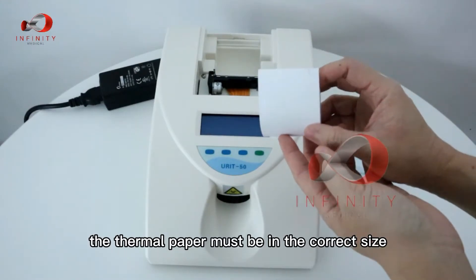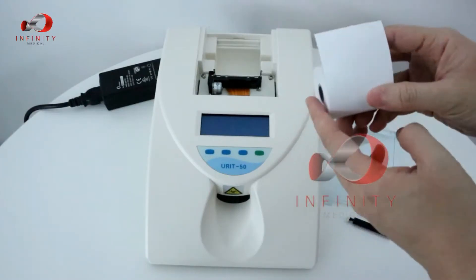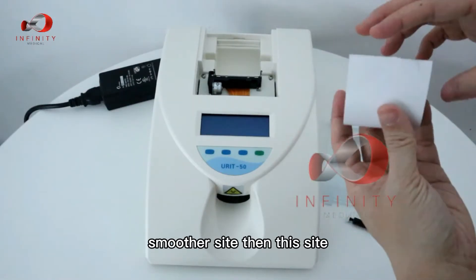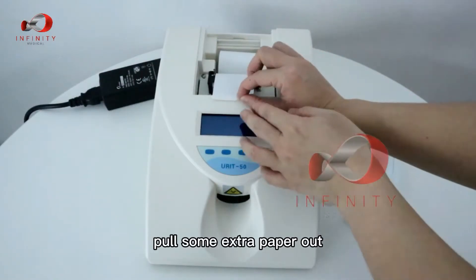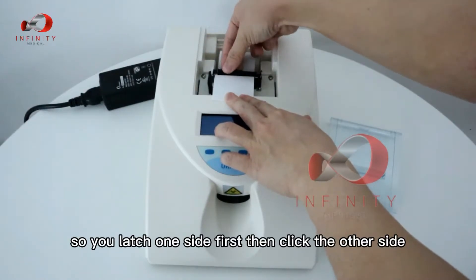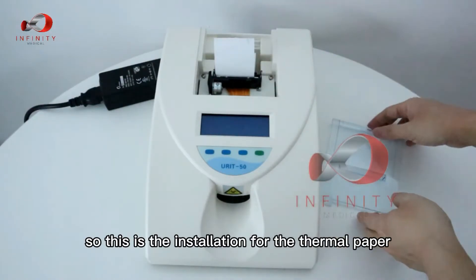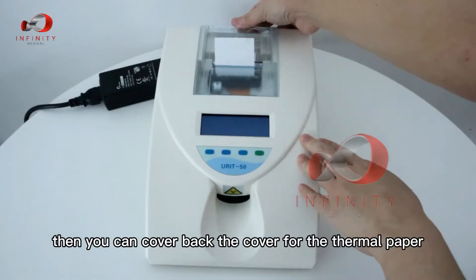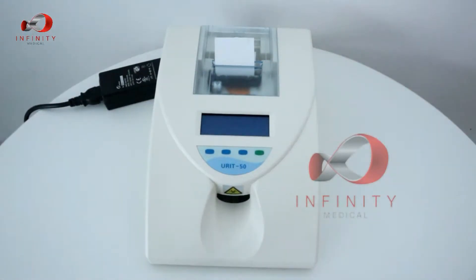The thermal paper must be the correct size with the thermal side on top. Check that you have the smoother side facing up, pull some extra paper out, then latch in the roller — latch one side first, then click the other side. Close the cover. The thermal paper installation is now complete.